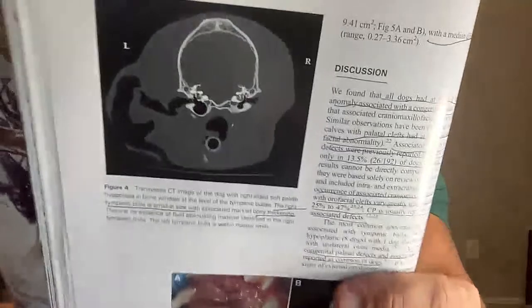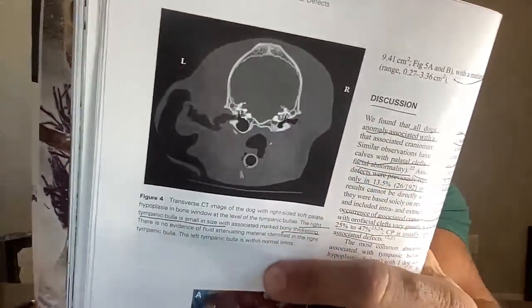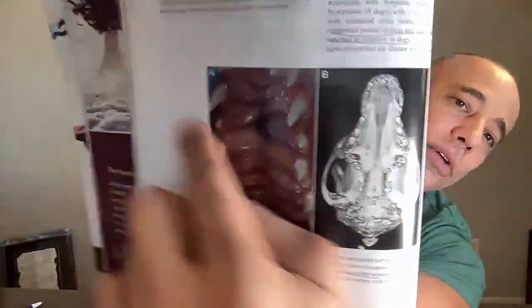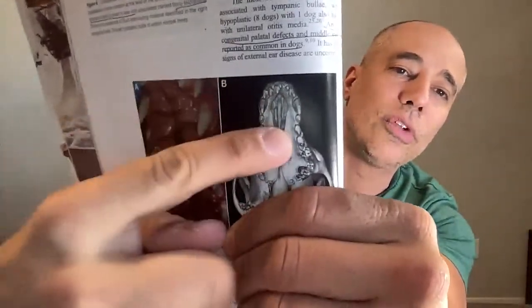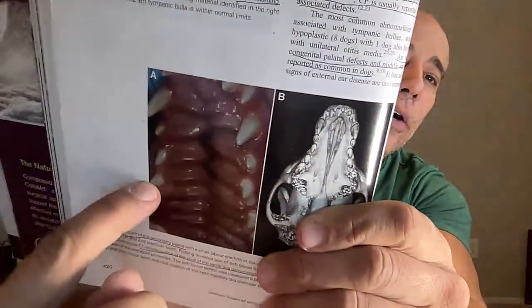Here you can see another CT scan. Notice that the right bulla is small and thickened, and the left one is normal. Here's the left one, normal. And then here's a CT scan 3D reconstruction. You can see the massive midline, huge cleft there in the skull. And then here's a real picture of a dog of a cleft palate. That was difficult. Okay, discussion.